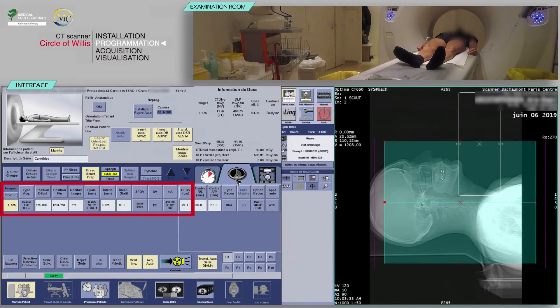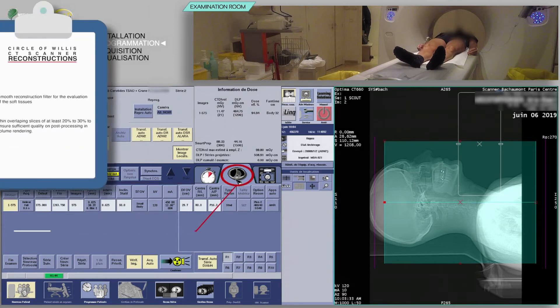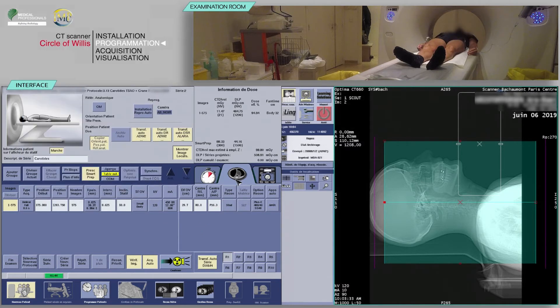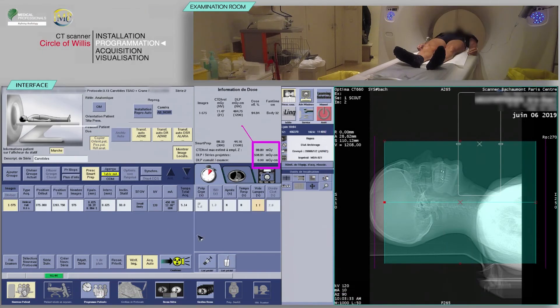Verify the consistency of acquisition parameters, which are often pre-configured. Check the reconstruction boxes. Typically, you will need a reconstruction with a smooth filter and thin overlapping slices of at least 20 to 30% to ensure sufficient quality on post-processing and volume rendering. Before continuing, check that the predicted dose is consistent with the diagnostic guideline values.